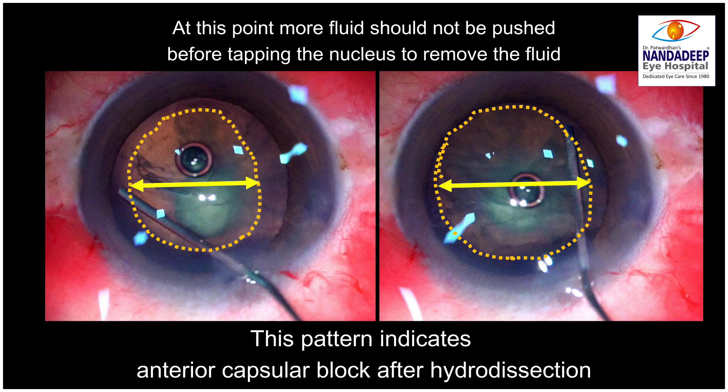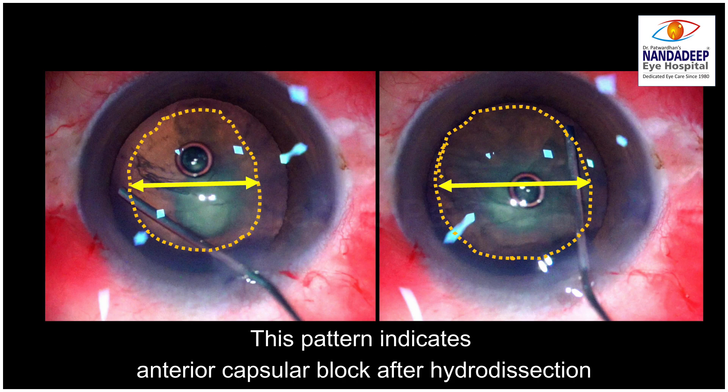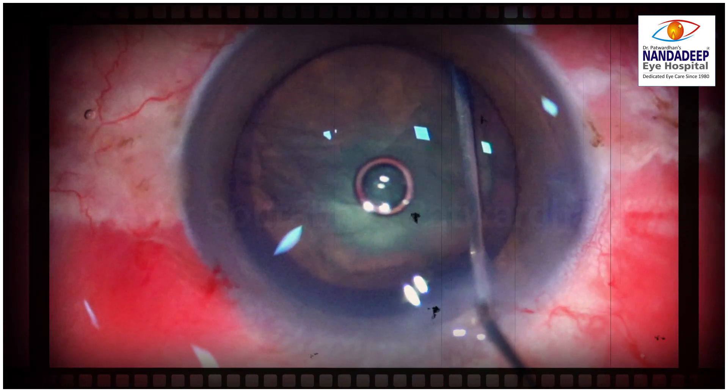This pattern indicates anterior capsular block after hydrodissection. So do recognize this pattern in your next case and avoid this pupillary snap sign.